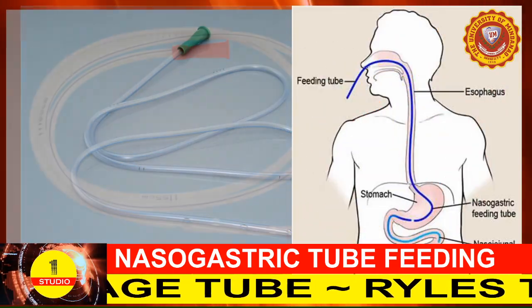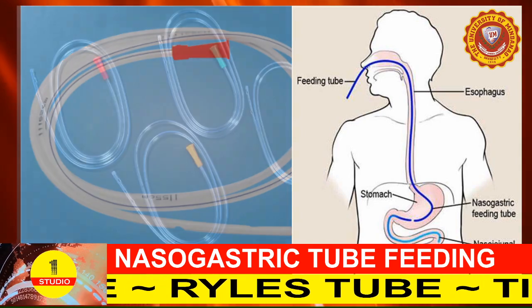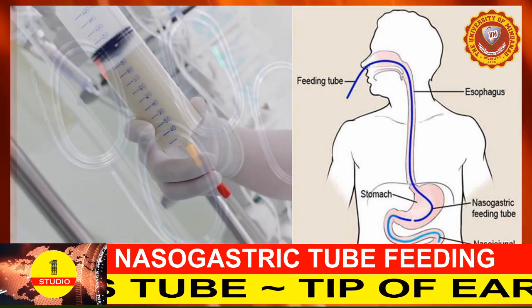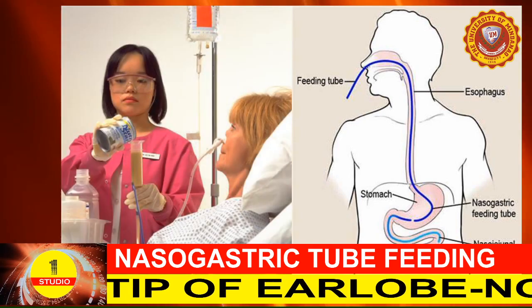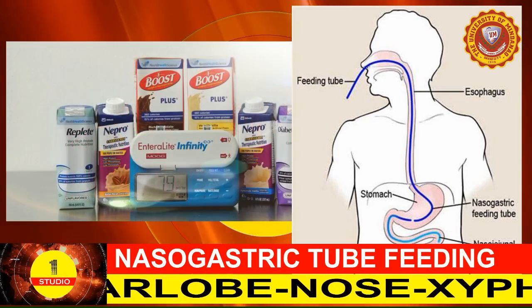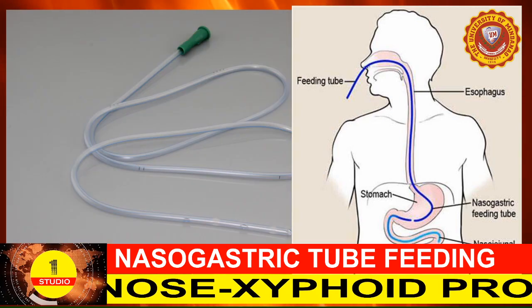A nasogastric tube, or NGT, is a special tube inserted into the client's nostril, through the esophagus, and down to the stomach in order to administer the prescribed calculated formula feed and/or medications.